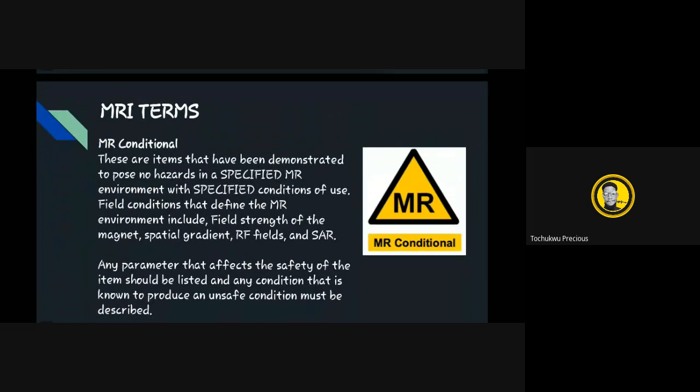Then we have MRI conditional. These can be used in specific conditions. There are some magnetic fields in which you can use them, and there are others in which you cannot. They have specific conditions, maybe due to the field strength of the magnet or due to the RF field. So for MRI conditional, you have to find out about whatever equipment it is. Find out if it's conditional and related to your machine specifications, and whether it can be allowed in.